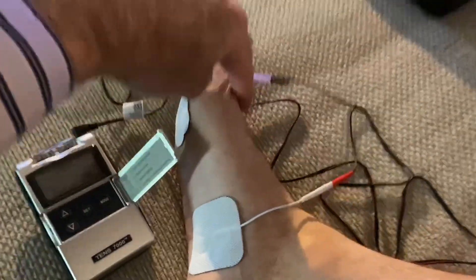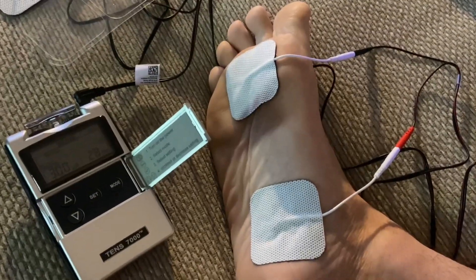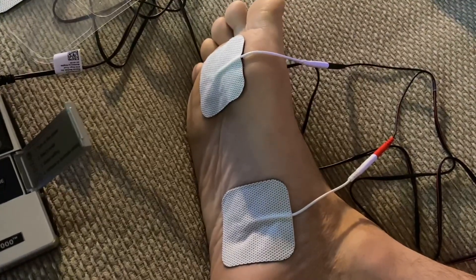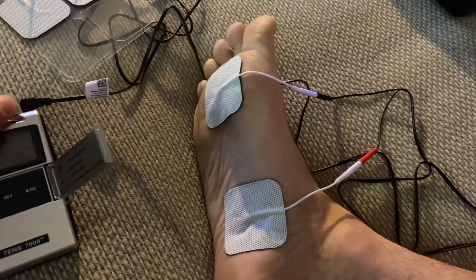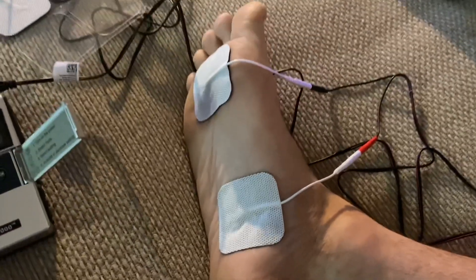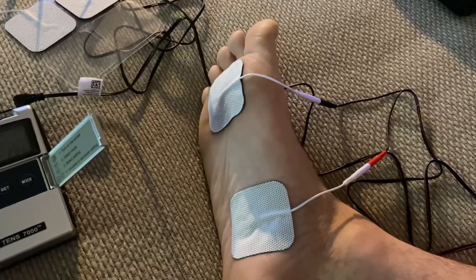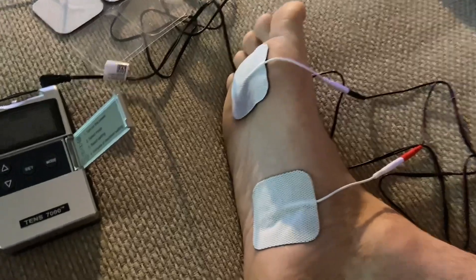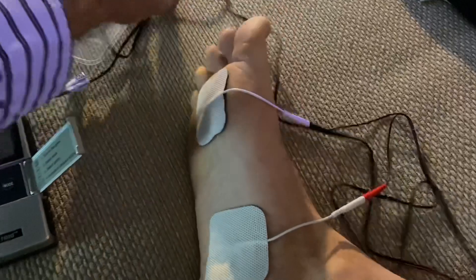I feel it all the way up into my toe. I'm going to try to turn it up a little bit. I turned it up to three — look at that, it's doing it. That's intense, but it feels pretty good. It's kind of like I'm getting an exercise but I'm not doing it.